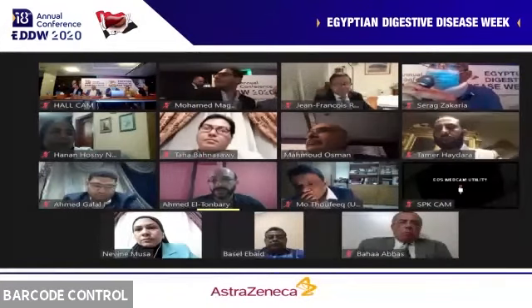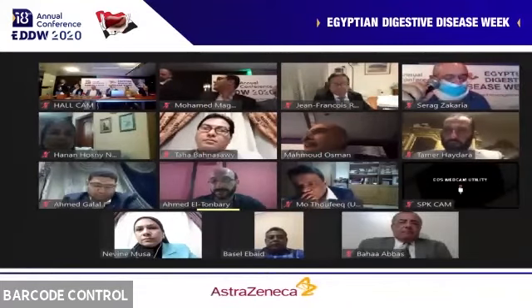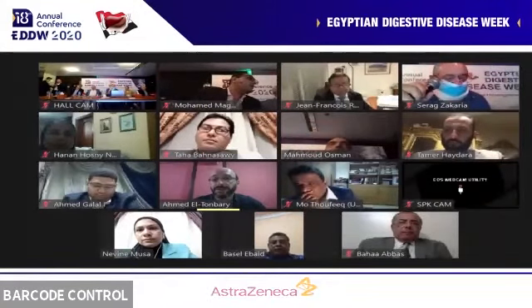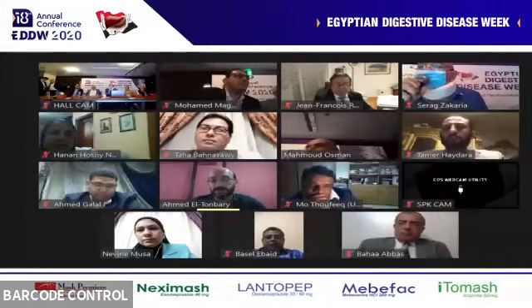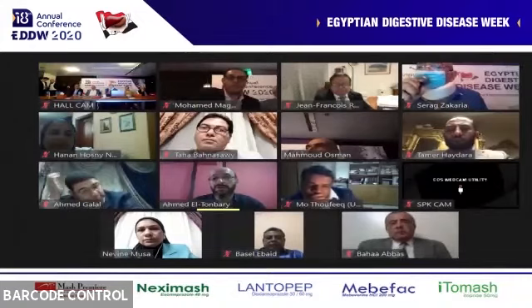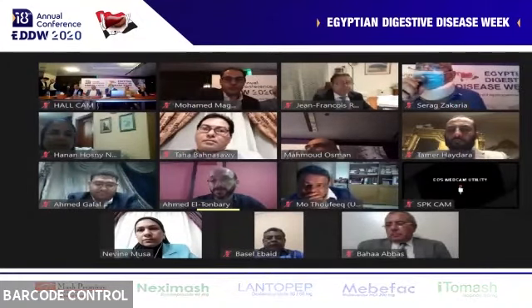The second part is morphological assessment of the surface pattern and vasculature, which uses Kudo pit pattern or NICE classification or even JNET if you have magnifying endoscopy. If you have signs of loss of pit pattern, which is type 5, either absent or irregular pattern, or if you have neovascularization, this is suggestive of malignant transformation or submucosal invasion.